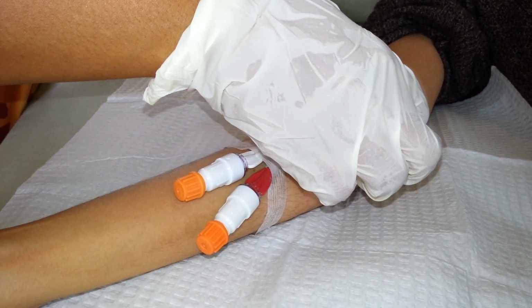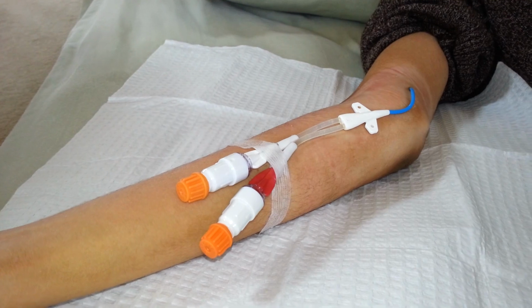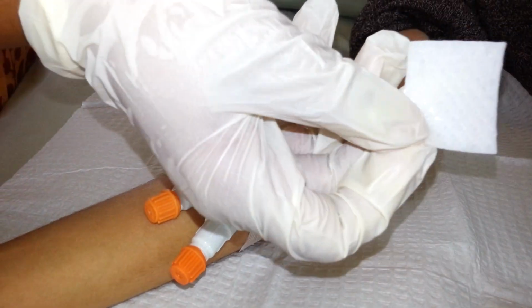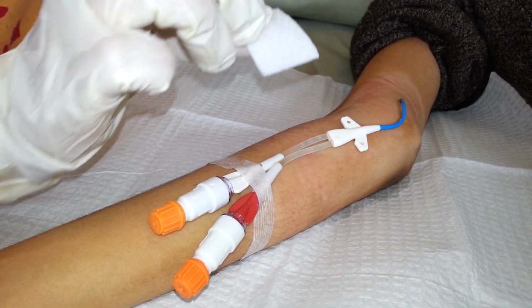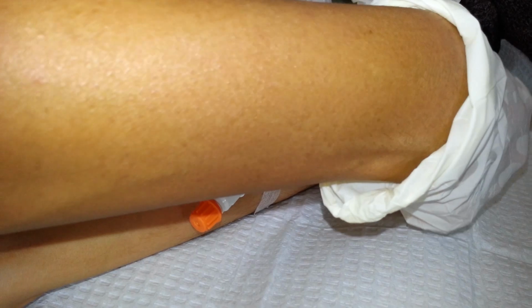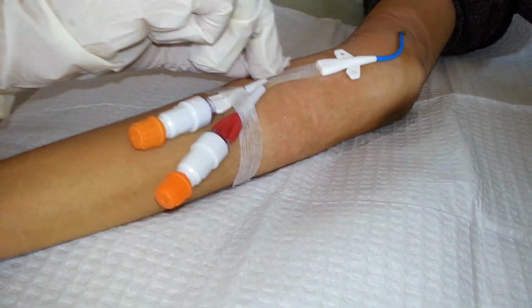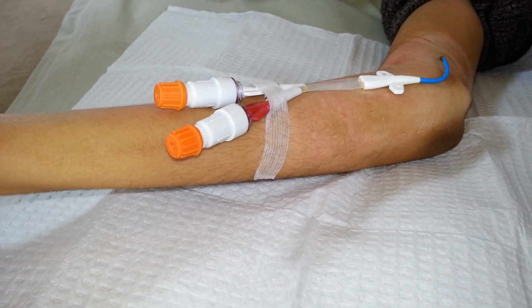So now we will use the skin protectant, skin prep on the side. This puts a thin layer on the skin so that the adhesives will not irritate the skin. Since I started using this, I have had no irritation or rashes. We just dab it on the area around the insertion point, but not on the insertion point, and we dab it around the remaining side and also let it air dry. So this has formed a thin layer of protection.